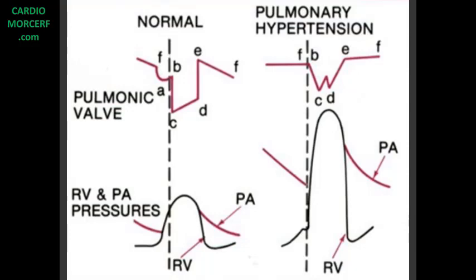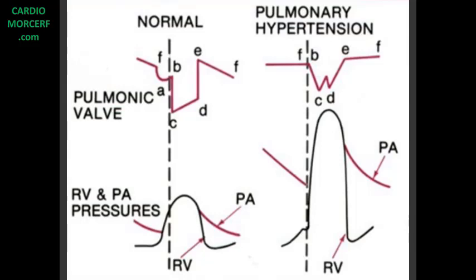If there is pulmonary hypertension, we are going to see some alterations in the movement of this valve. Notice that the valve lost its diastolic anterior-posterior movement — it may be horizontal. It has also lost the A-wave. Why does it happen? Because of the high pressure in the pulmonary artery, the increase in diastolic right ventricular pressure due to right atrial contraction is not enough anymore to initiate the opening of the pulmonary valve. The A-wave disappears.